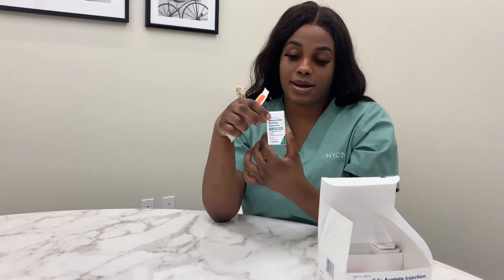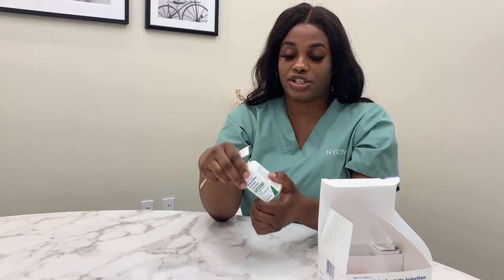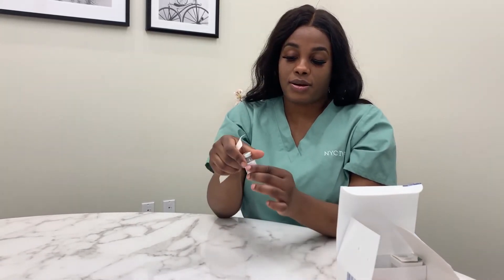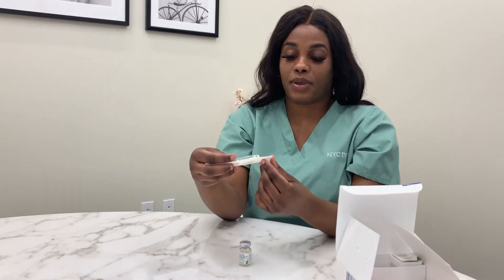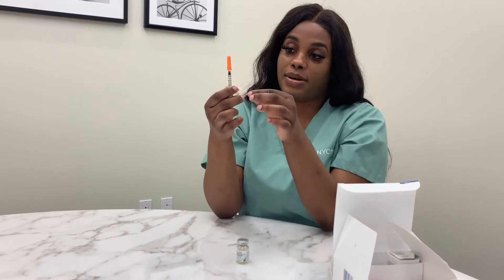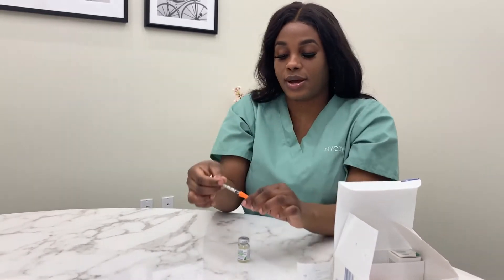The Lupron comes in a box with individual needles for your injections. You would remove the Lupron from its kit — this is what it looks like, and this is what the needle looks like. With the needle, we use the side with the whole numbers, so it starts from 5, 10, 15 units and so on.